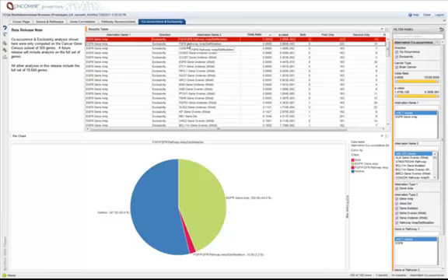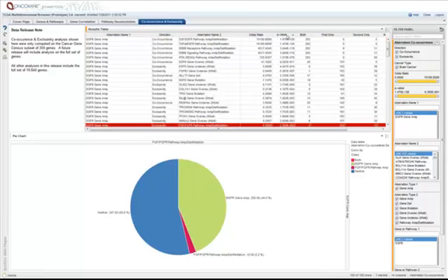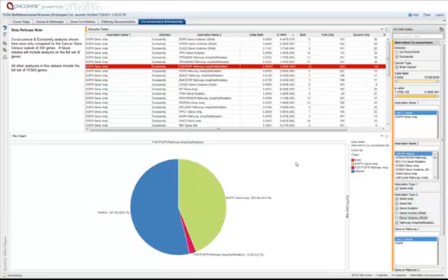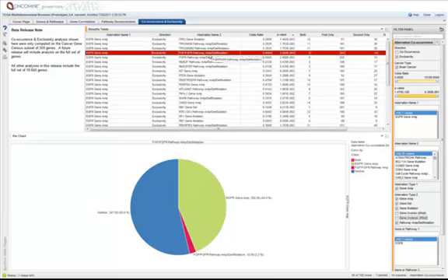We also see, if I sort here by p-value and focus specifically on the mutual exclusivity data, and we're going to turn off the expression data, what we see is mutual exclusivity with the p53 mutation. So not perfect mutual exclusivity, but certainly a significant trend.